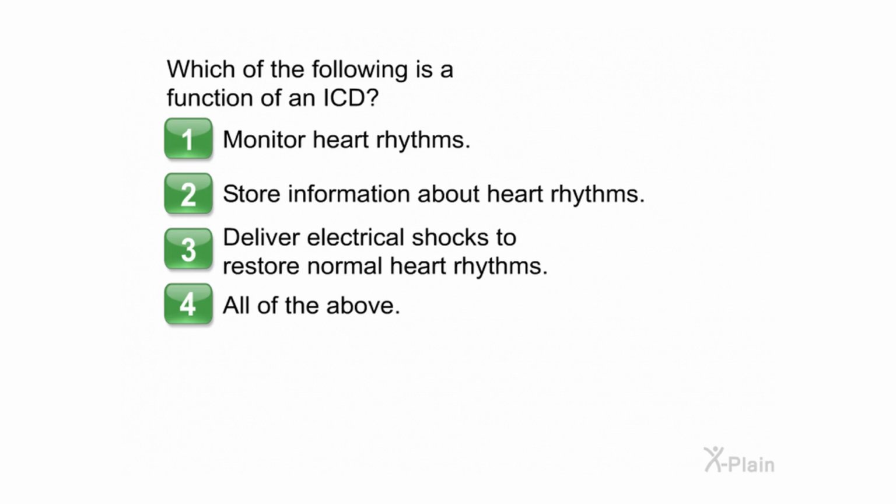Which of the following is a function of an ICD? Choose one of the following options. 1. Monitor heart rhythms. 2. Store information about heart rhythms. 3. Deliver electrical shocks to restore normal heart rhythms. 4. All of the above.